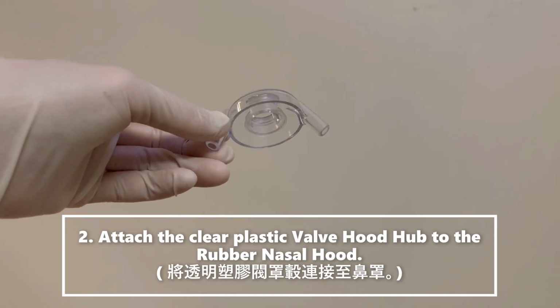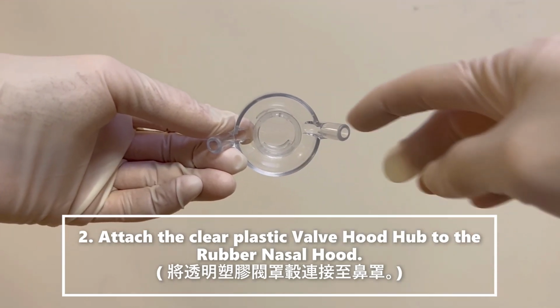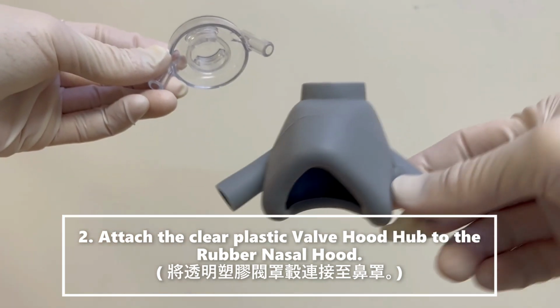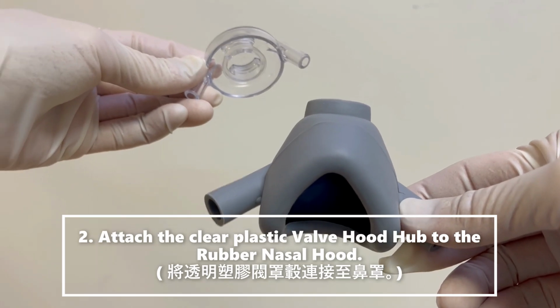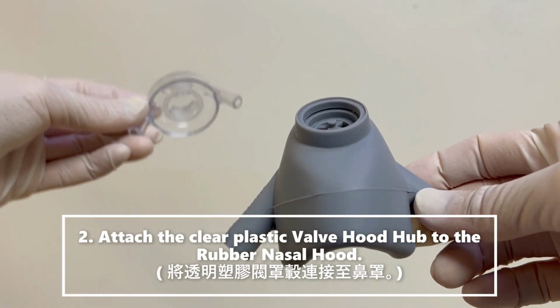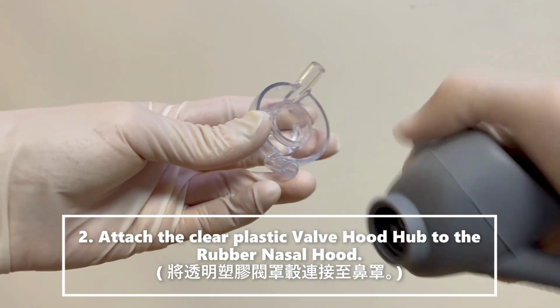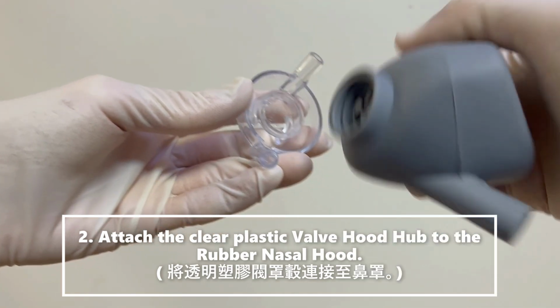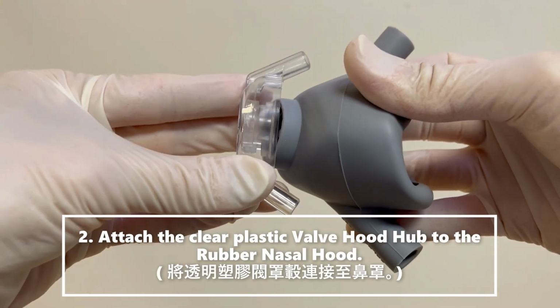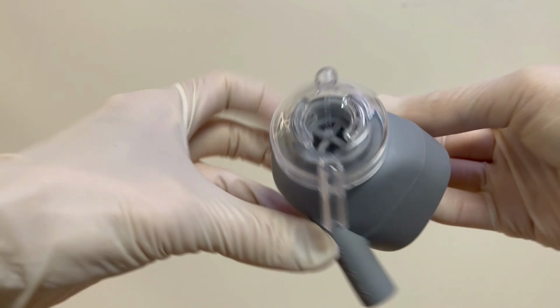This is a valve hood hub made of clear plastic material. This is where the exhaust system, the small tubing, goes in. Here is an autoclavable nasal hood made of rubber material. You can autoclave this. This one, you put in cold sterilization overnight. I'm going to show you how to put it together. You clip it on; there's a ring inside which goes into the ring inside here. Squeeze it. This is how you connect the two pieces together.